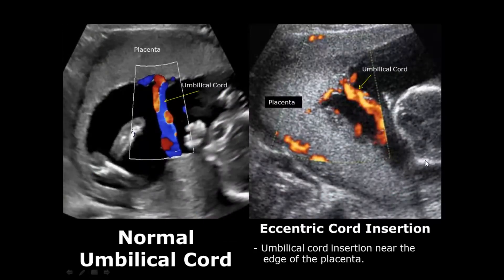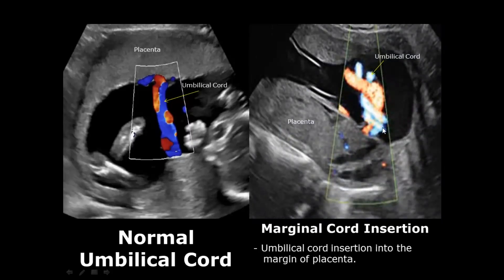Now we move on to umbilical cord insertion. Normally the umbilical cord should enter the placenta at its center. In the case of eccentric cord insertion, the cord enters near the placental edge instead of the center. In marginal cord insertion, the umbilical cord enters the placenta at its margin — the placental edge — instead of the center.